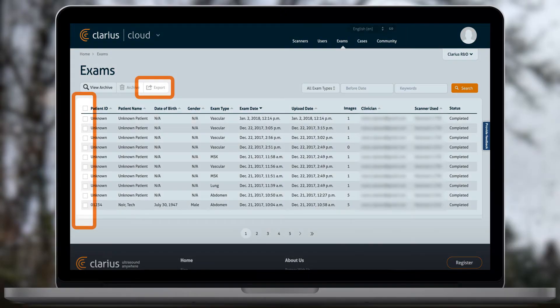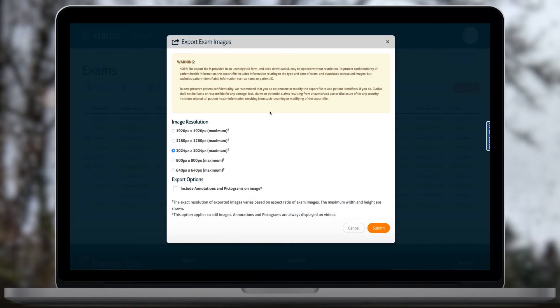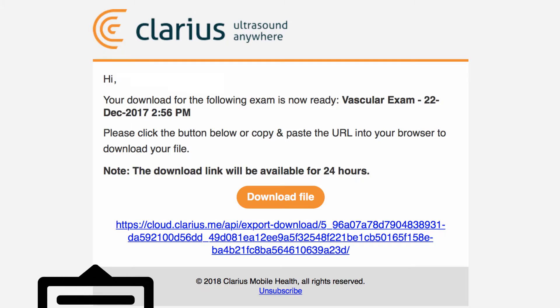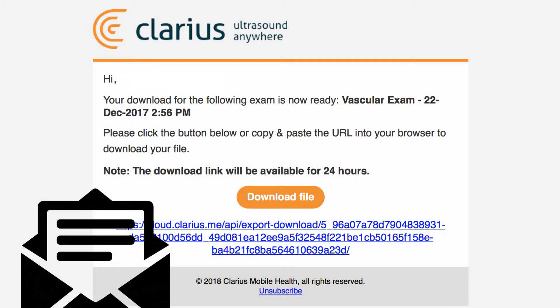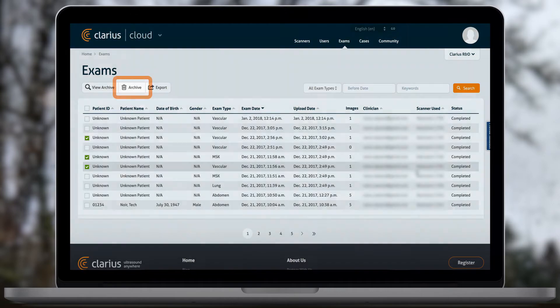You can also export images from several exams on the exams page. If you wish to delete an exam, you can archive them from the exams page. These exams will be hidden from your list and will not count towards your storage quota.